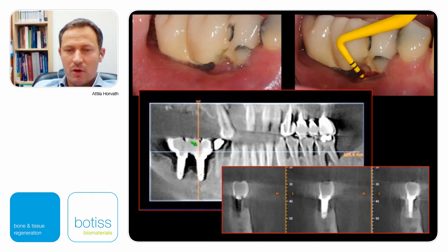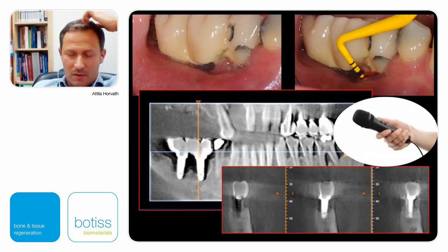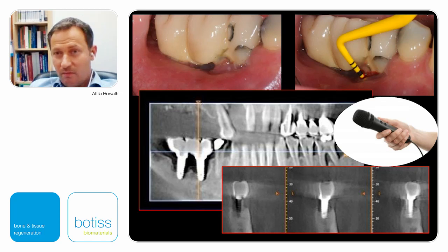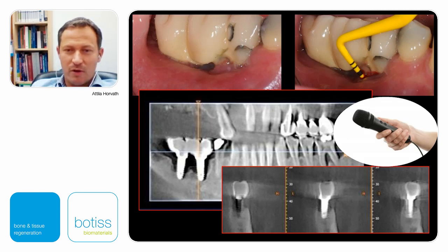So underneath there are two implants, and as we see in the CT scan, the bone level is not in the ideal position at all. So now we could put a question again to us or to everyone else: in that situation, how should we go on? I kindly ask you to take a few seconds to discuss and consider what to do. Extract these implants, or leave it and do some regenerative, maybe resective surgery, or leave it as it is.